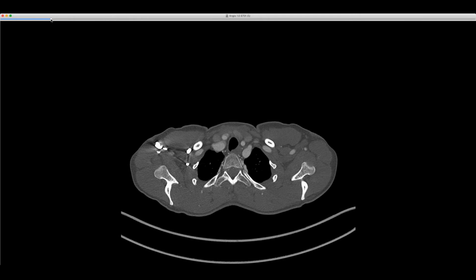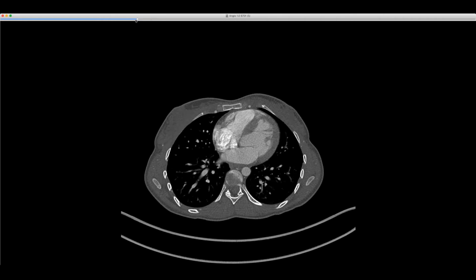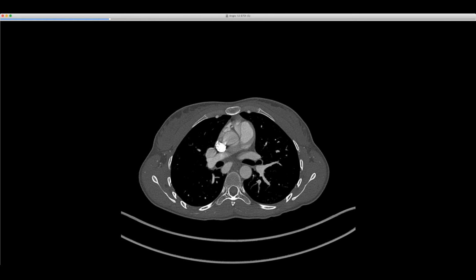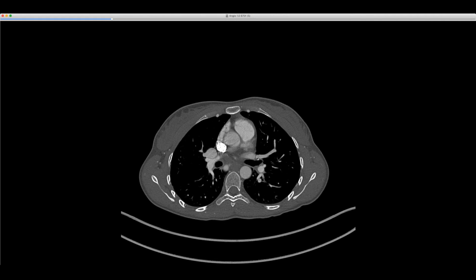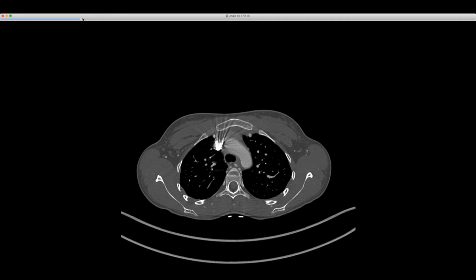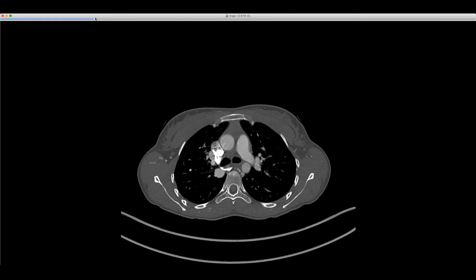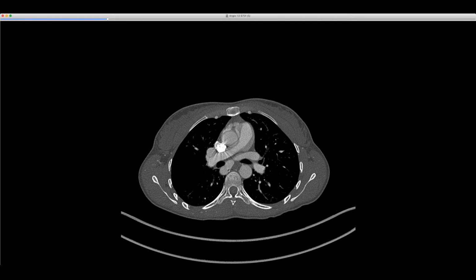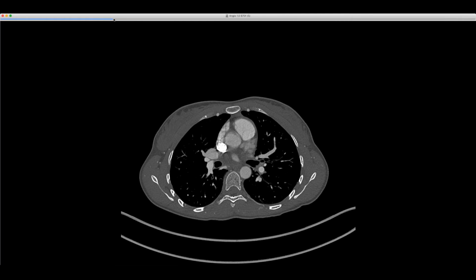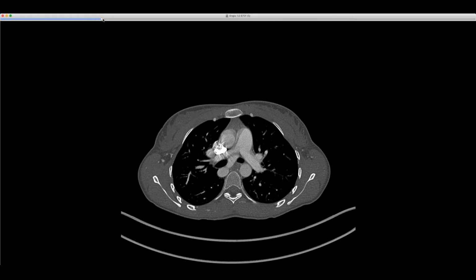Yes. Okay. So this is a very interesting case. I've never seen this particular variant before, but when I first saw this, I saw an interesting vessel that is crossing across midline here, and I should say that first of all, this is a patient who has a coarctation. You can see the aortic coarctation right there. You can also see that there's a little patent ductus right there, and that was really the reason for the CT. But you can see that there's an abnormal vessel that is crossing from left to right, and it's really crossing behind the pulmonary artery, and you can trace this to pulmonary veins, and you can see the pulmonary veins draining here into this large venous structure, and that crosses midline.